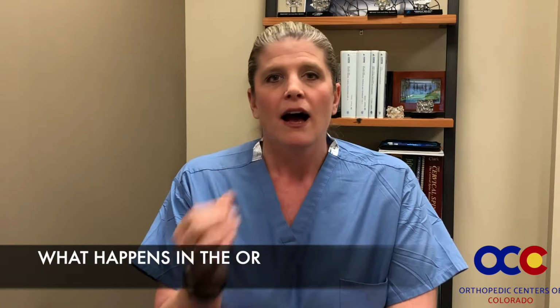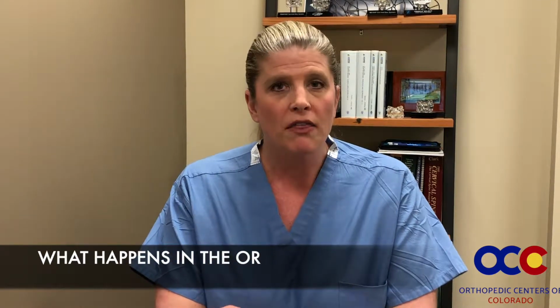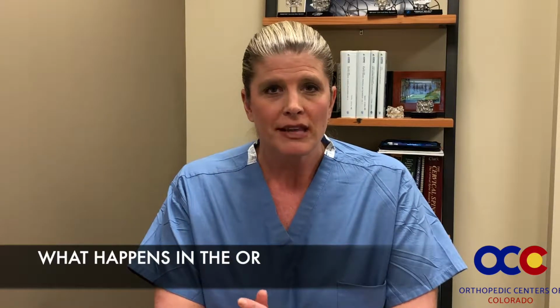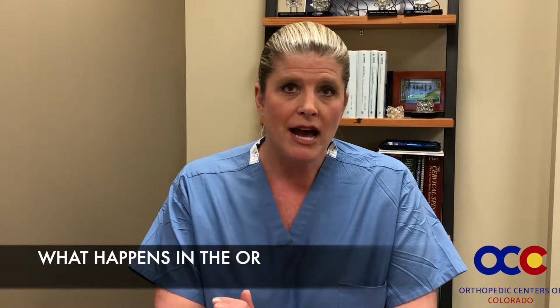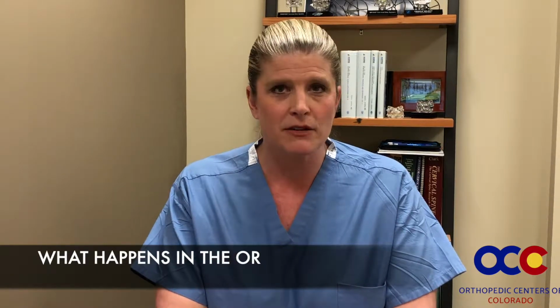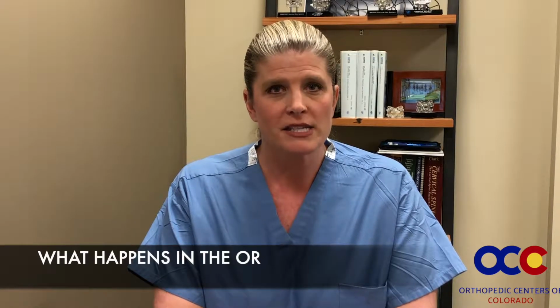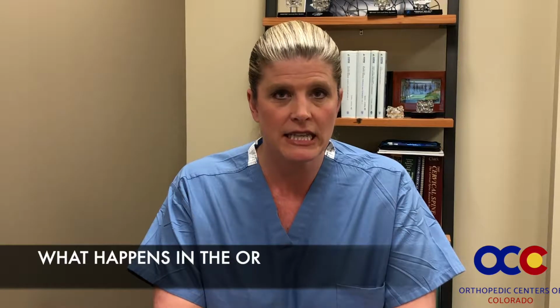The incision with this procedure is typically always made on the left side of the front of your neck. There's no big muscles that we cut through during this procedure. There's just a small, thin one that we go through. And that really helps this surgery not be that painful. And once we get through that thin muscle, we'll just get down, be able to push things aside and slide down to the spine. And once we get to the spine, we'll bring in a microscope so that both he and I can see everything nice and clear.